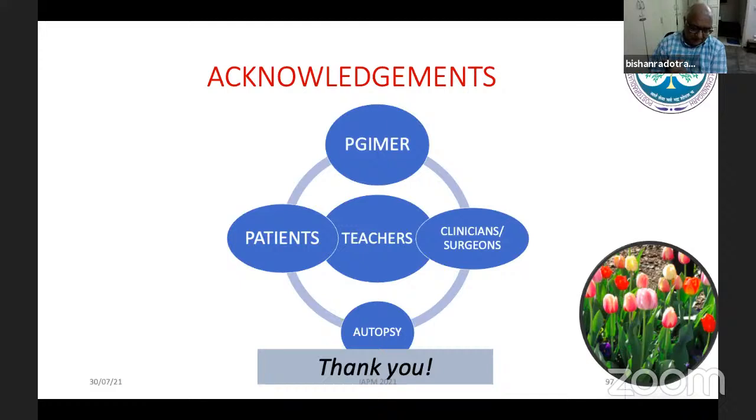Like GI resections and stenosis, that's one area where if we pay heed, we do come up with it. But most often we say consistent with gangrene. That is not enough. You don't have to leave it there. You have to give a cause. And if we make an attempt, we do find it out. You have to be very quick also.